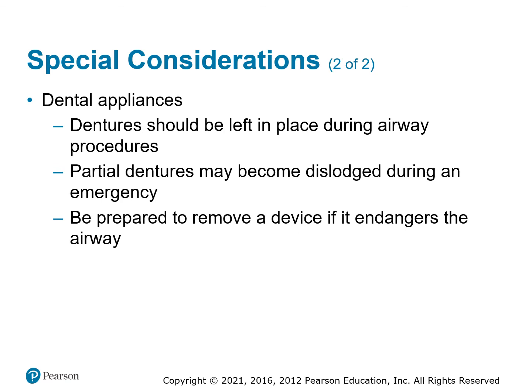Dentures should be left in place during airway procedures. If they do become dislodged, you can take them out, but when you take dentures out, it leaves a lot of extra space and loose flapping lips, and actually makes it harder to ventilate.